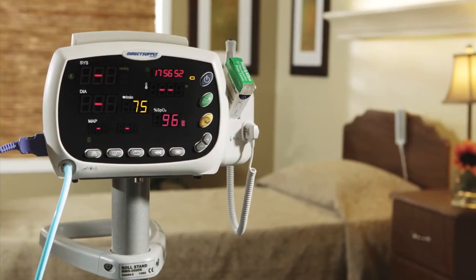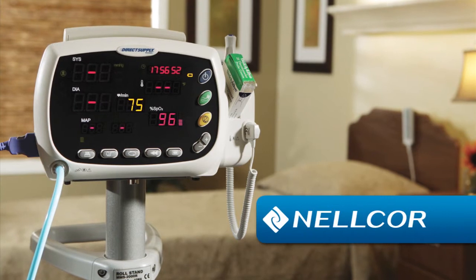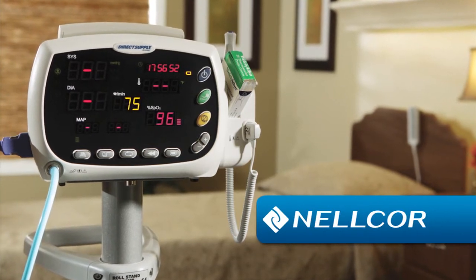The Attendant Vital Signs Monitor uses the algorithm from Nellcor that offers fast, accurate readings.